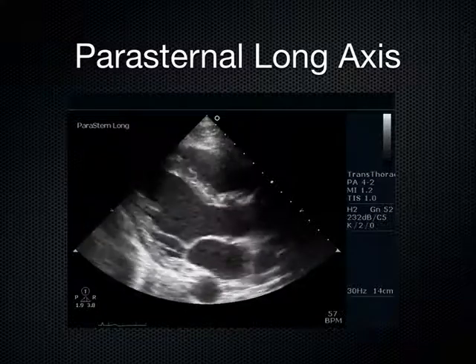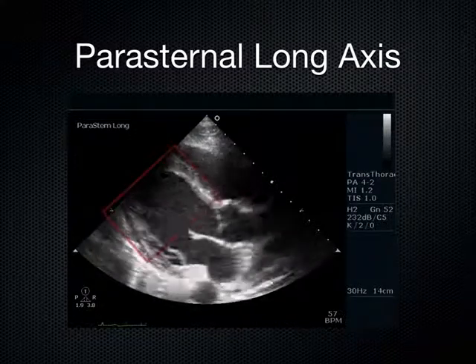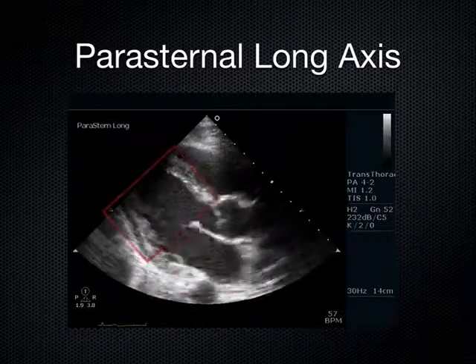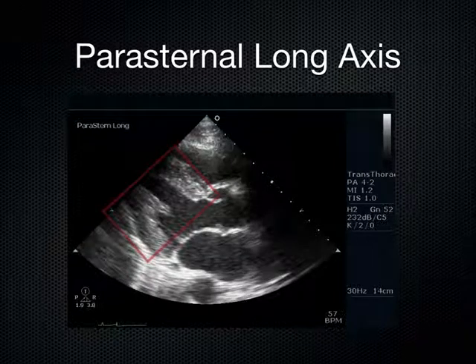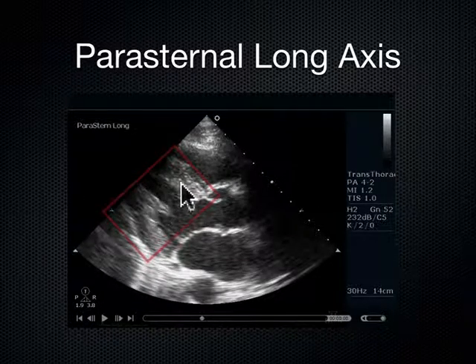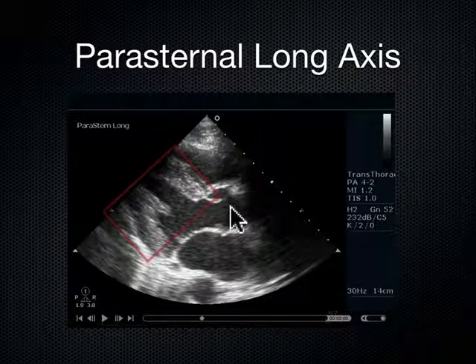Now, we come over and look at that interventricular septum and its movement towards that left ventricle. Let's call this right here end systole. How do I know that is end systole? Well, the posterior wall and the interventricular septum are close to each other right there, and this aortic outflow tract, that's open. This is the one leaflet of this aortic valve.